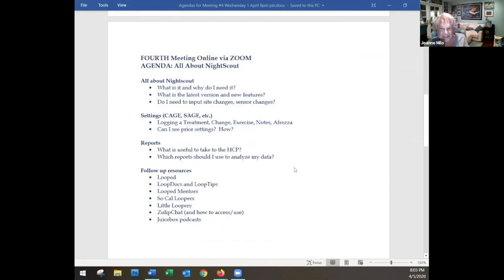This is a cool day because Nightscout is a very powerful tool. It's been around quite a while.